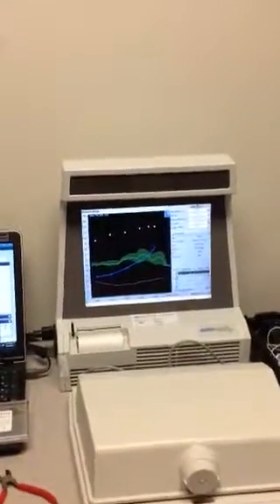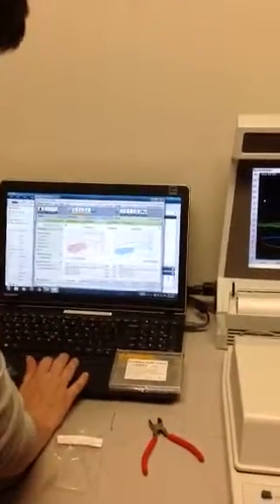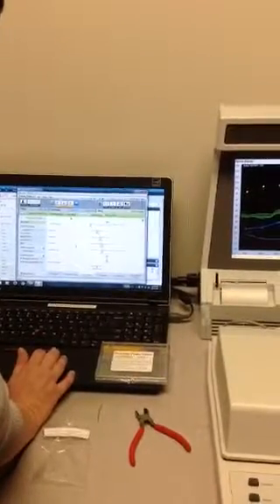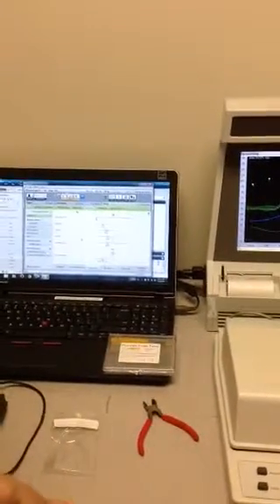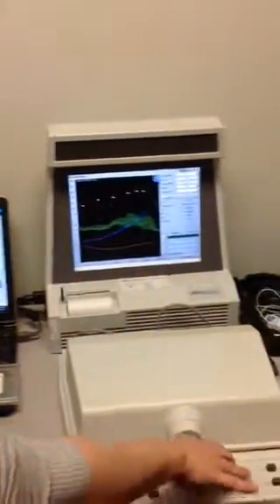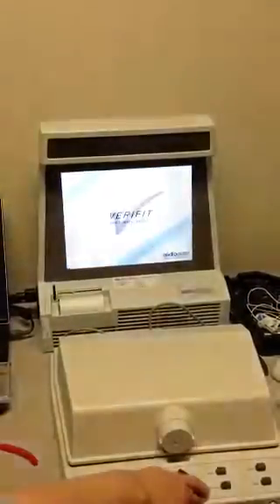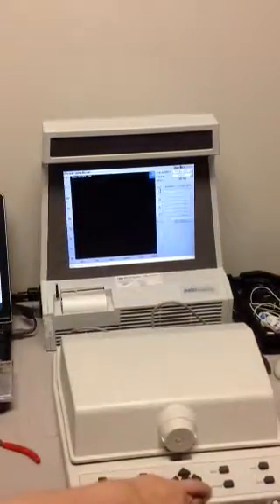We're going to do a directional microphone verification. So I'm going to go into my program options here so that I can change the microphone settings. So to do a directional microphone test, you go back to your test menus. You're going to go on your measurements and then select directional. And for this test, you have to have a rear speaker.